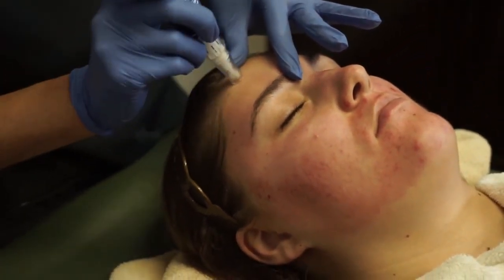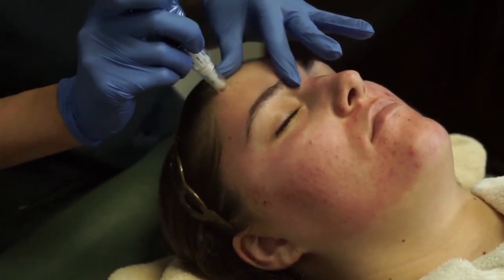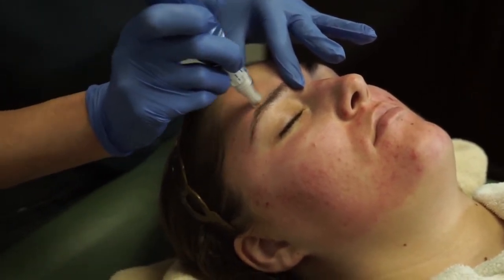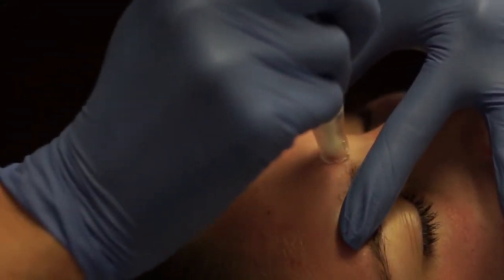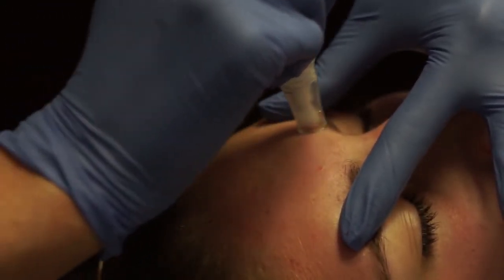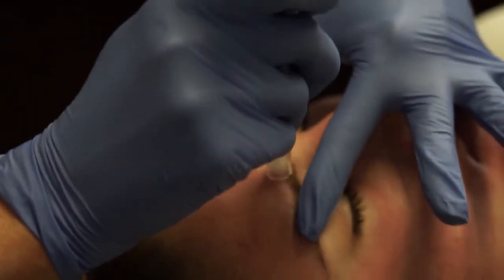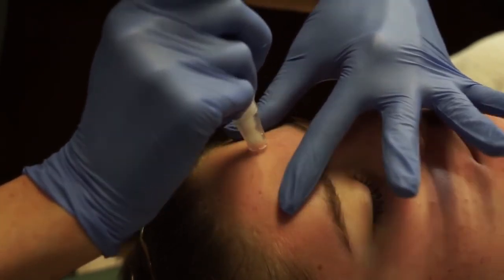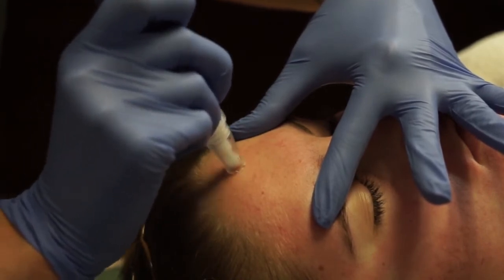Now, the forehead area, based on this study, has an average thickness of around 1.2 millimeters, with the glabella area coming in a little higher at 1.4 millimeters. When treating the glabella, make a V shape with your free hand by placing a finger above each brow. This will allow you to lift and access the natural furrow of the glabella area during treatment without applying additional pressure to the device. Finish off each section of the forehead, achieving a similar erythema endpoint as the rest of the face and overlapping areas with deeper acne scars as needed.